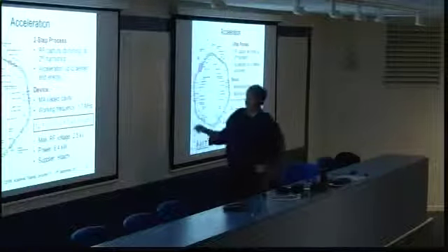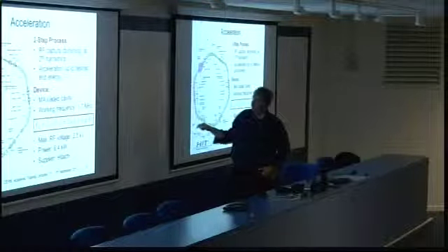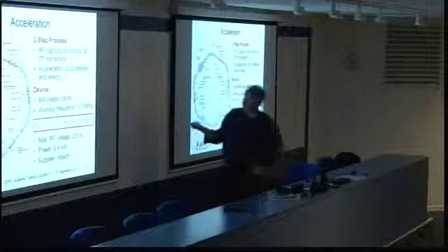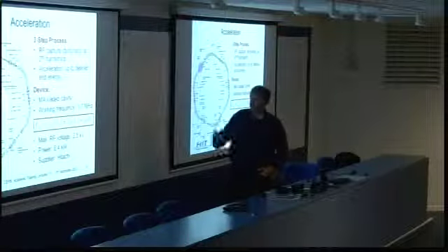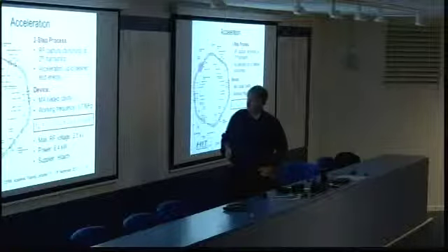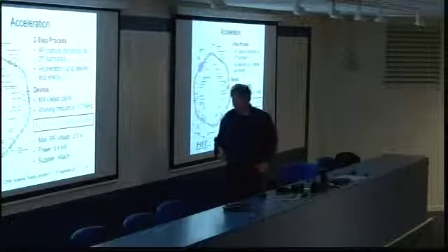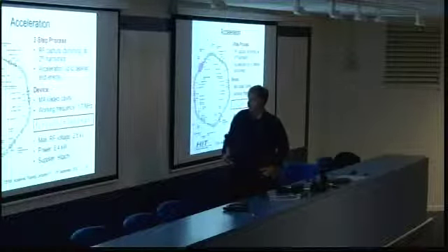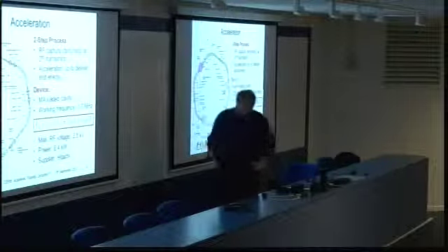And well, therefore, when we go to the second harmonic, we have a working frequency at the injection of about a megahertz. And then you capture the beam, and afterwards you accelerate the beam to the desired end energy. The device used for that is a MA-loaded cavity, which we got from the supplier Hitachi. The maximum voltage is not very high, 2.5 kilovolt. But as I said, the energy gain is done in every turn.